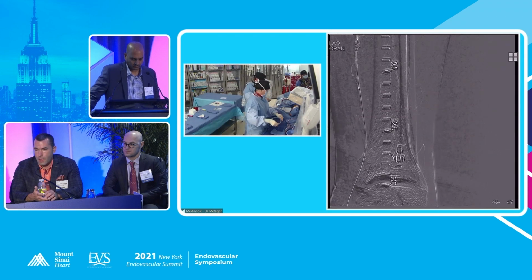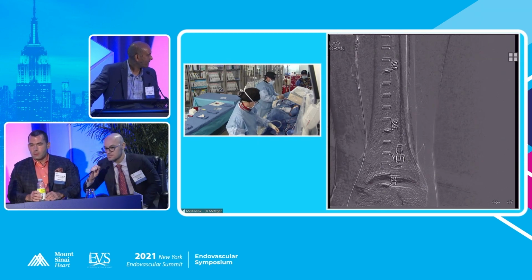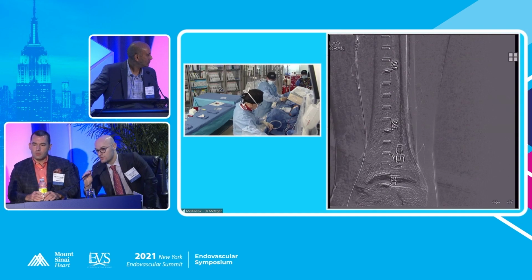In my view of the distal foot film, it looked like once you got to the ankle, everything really opened up. There are several skip calcific lesions along the way that you need to open up and fix. Eric, any thoughts? Anything different? I would agree with that.